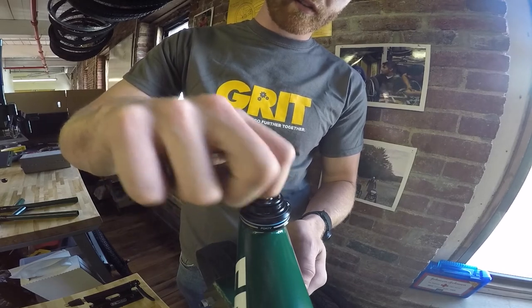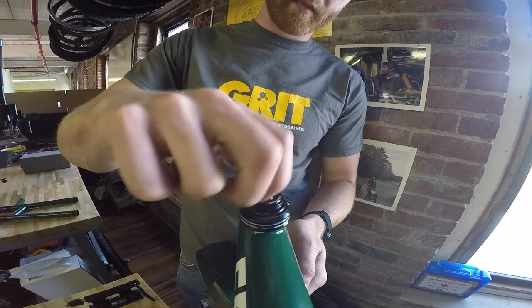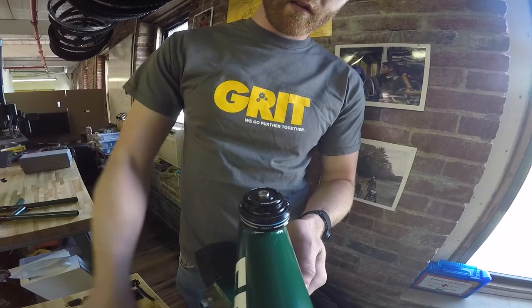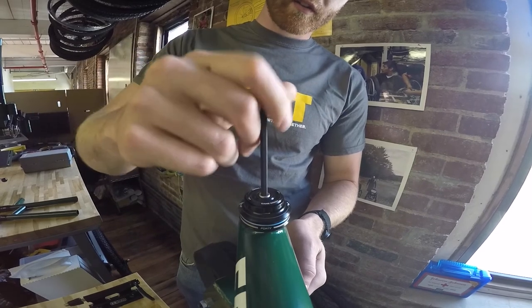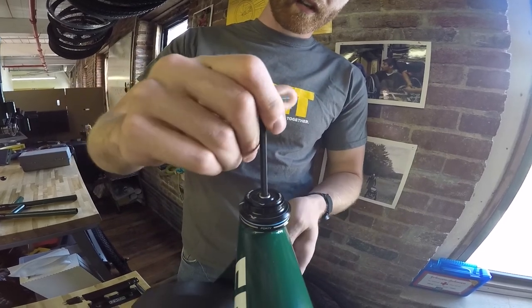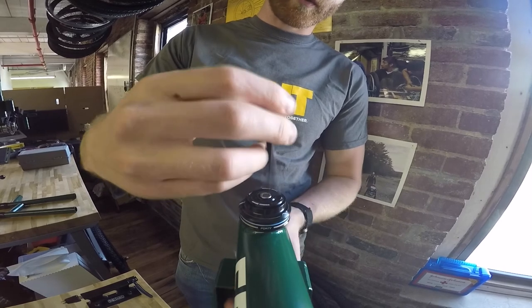There's a star nut that's recessed on the inside that'll draw up the bearing assembly. Take your 5mm Allen key and draw it so it's snug. You pretty much tighten it until you have a little bit of resistance in the caster swing.